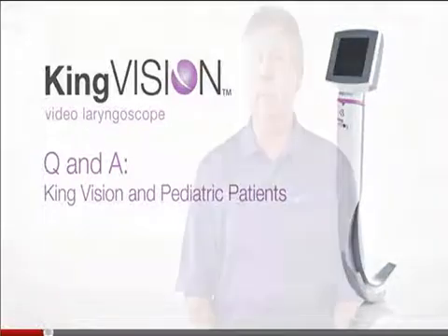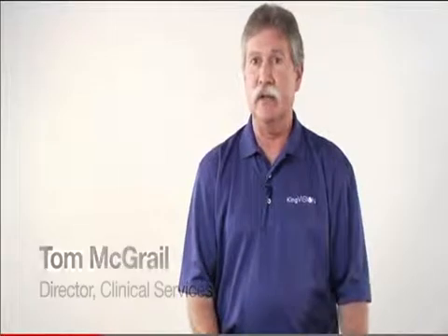This is a common question that we get: when are we going to have pediatric sizes, or what size patients can the existing size 3 blades be used on? Clearly we're working on the pediatric sizes. The dimensions are clearly different. It's not just a downsizing. The anatomy does change with the development of patients from infants to adults. Again, the analogy is whoever you would be comfortable using a Macintosh 3 blade, and this would obviously include some adolescents and larger kids, but it's clearly up to the clinician and looking at the size of the patient as to when they would be comfortable using either blade. And obviously the mouth opening requirement would be a factor as well.